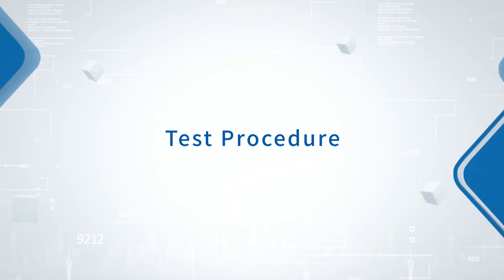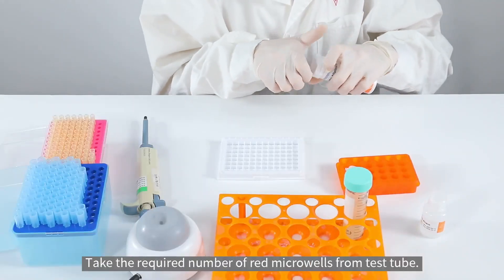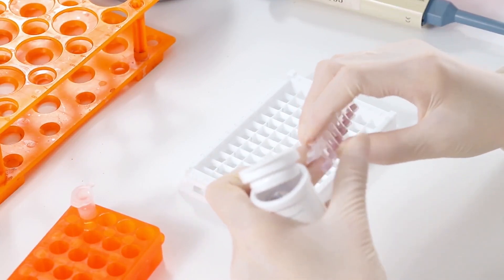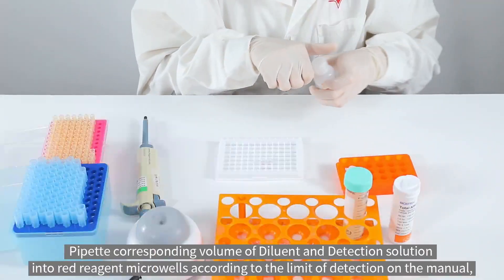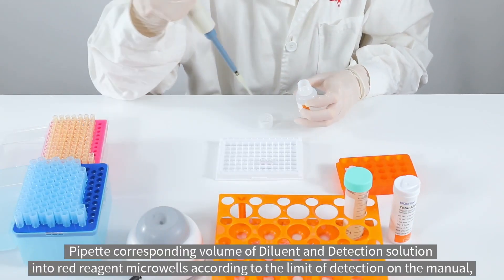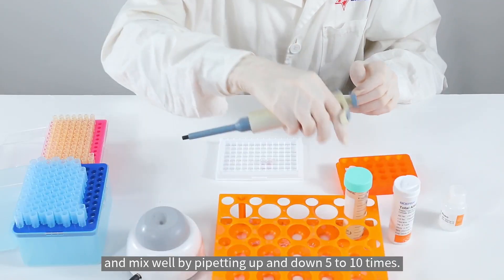Test procedure. Take the required number of red micro wells from the test tube. Pipette the corresponding volume of diluent and detection solution into the red reagent micro wells according to the limit of detection in the manual, and mix well by pipetting up and down 5 to 10 times.